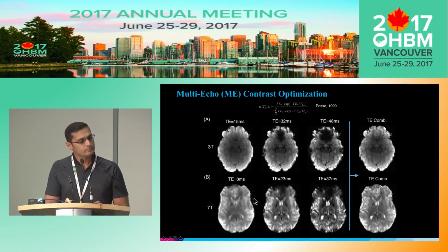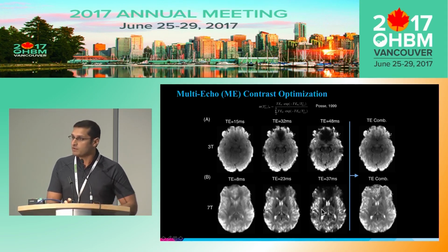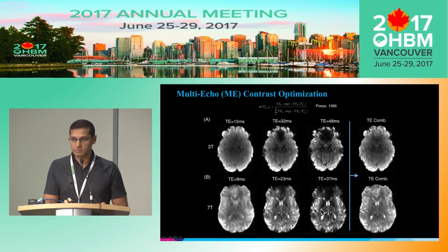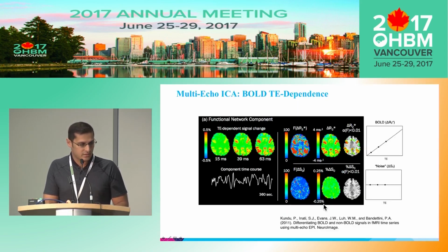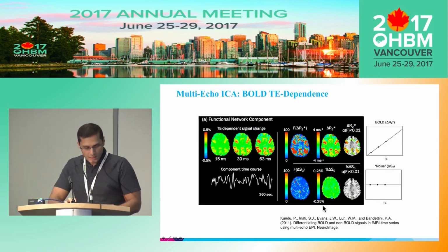And this plays out at 7T as well, and it's even more important at 7T because T2 star is even more varied at ultra-high fields, and as more 7T systems hit scan centers, this will be understood a little bit more: higher fields equal more variability, but with a multi-echo approach, you can compensate for many of the issues related to that. So how does this work?